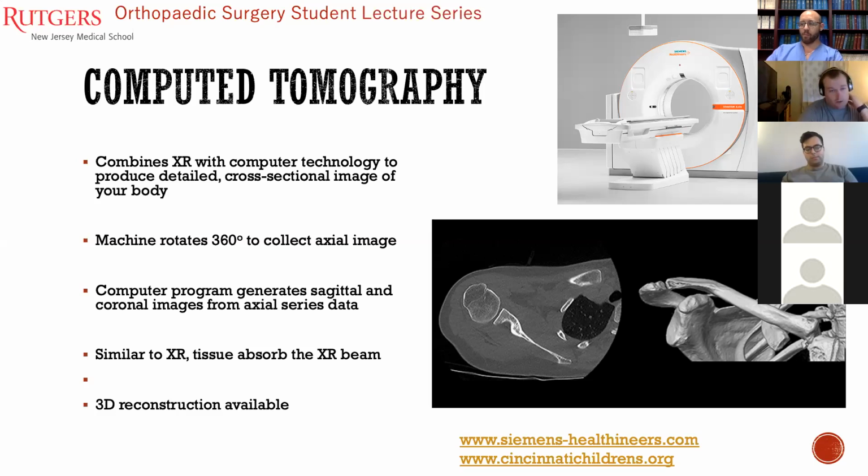Exactly. And again, that goes back to the fact that CTs typically are easier to get in many institutions as compared to MRIs, such that if you're looking for evaluation of an abscess or fluid collection, you can give a patient contrast and have a CT done fairly quickly, whereas an MRI, which would also show you soft tissue and fluid collections, would take longer and is generally more expensive in most institutions.